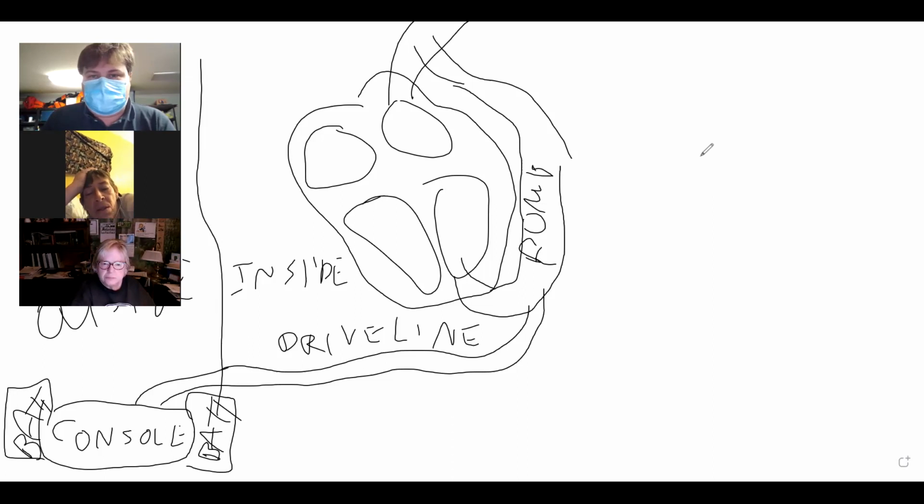It's very uncommon for hospitals in rural areas such as northern New England to actually perform this procedure where they install a ventricular assist device. So if you depart the patient's home and forget to take all of this equipment with them, it is not likely that any of the hospitals in our area would be able to supply that equipment. And if they are running out of time to get back to their house before the pump dies, we might be up a creek without a paddle.